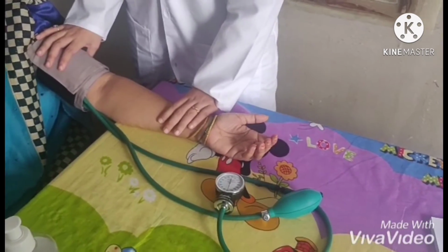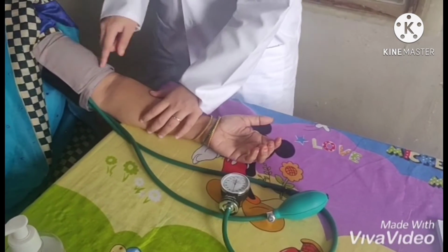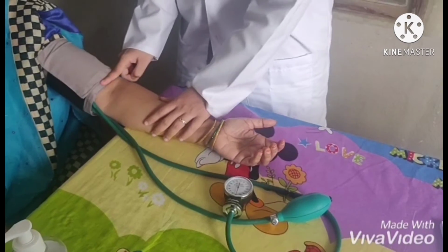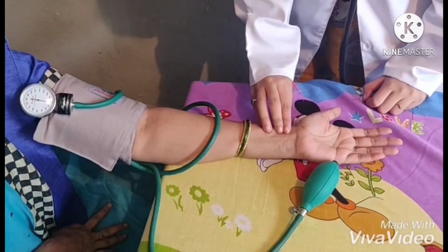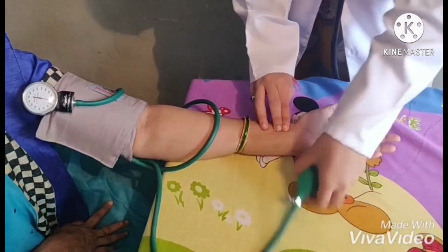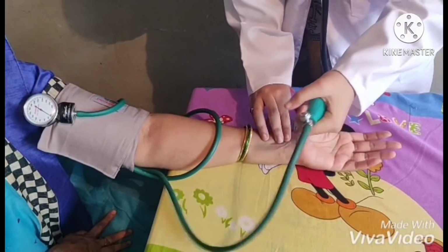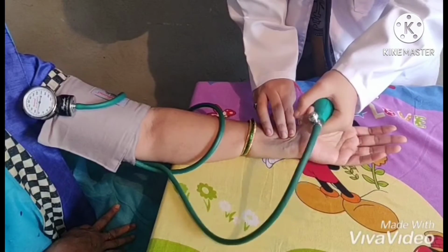Procedure. Apply the cuff as we described. Make sure the lower edge of the cuff is 2 cm above the level of the elbow. Starting with the palpatory method, palpate the radial pulse. Inflate the bag gradually till the radial pulse at the wrist disappears.